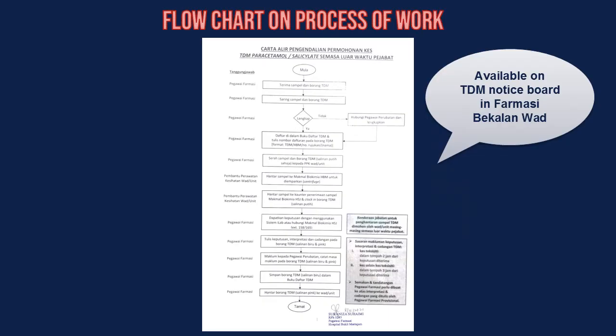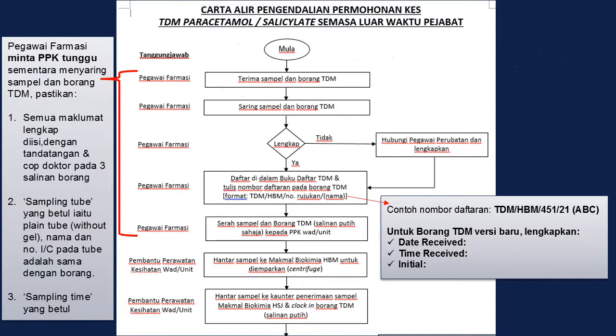This flowchart on the process of work is available on the TDM notice board in pharmacy Bekalan ward. It's important to follow strictly every single step in this flowchart. Pharmacists on duty will be responsible for the screening and interpretation of results.